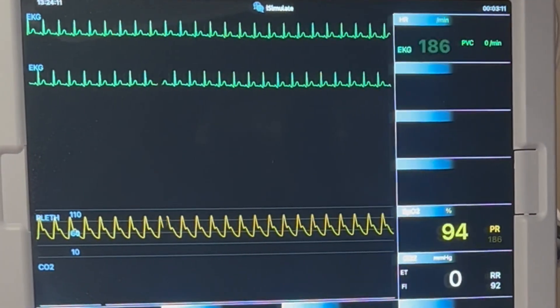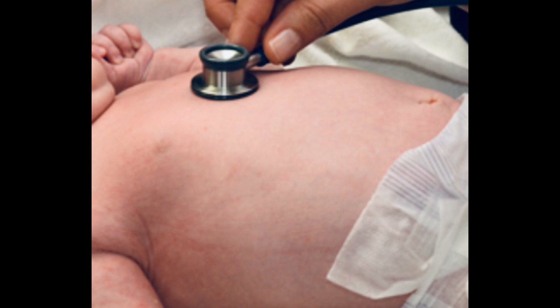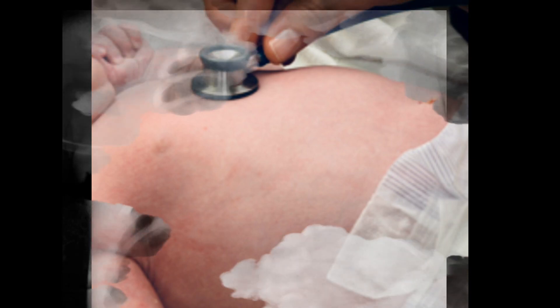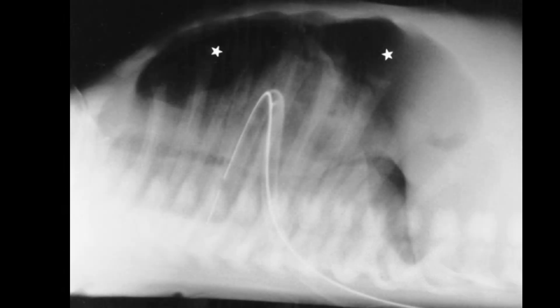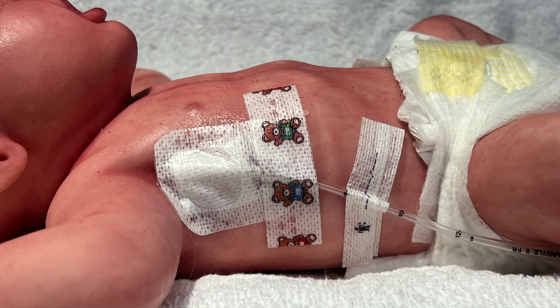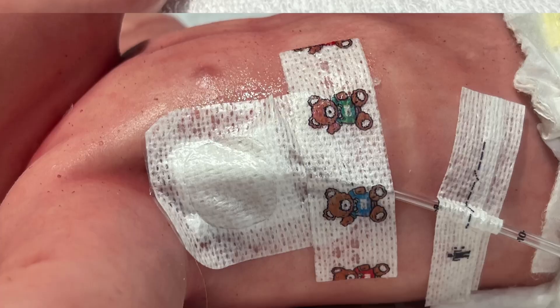Throughout the procedure, you'll want to perform cardiopulmonary monitoring and assess the patient before and after the procedure is completed. You'll also want to obtain a chest x-ray for verification of catheter placement and resolution of the pneumothorax. If the pneumothorax is not resolved or there is no bubbling in the water seal, you may consider a cross-table lateral, such as this one, to verify that your placement of your tube is actually anterior rather than posterior, as seen here. Once satisfied with placement, you can now cover the site. Again, you'll need Vaseline gauze against the skin. You can cover that with a 2x2 gauze, and then secure it all with a Tegaderm, as seen in this picture.